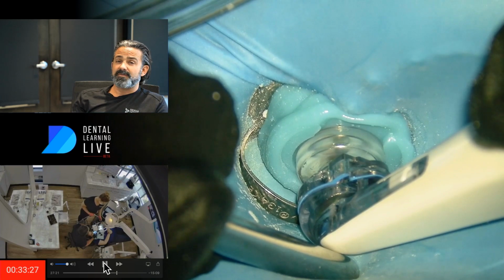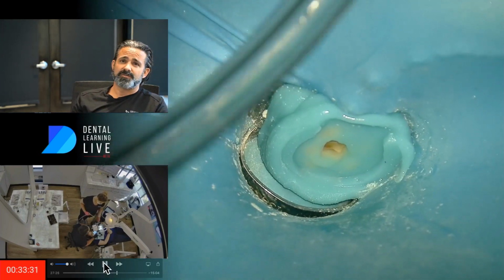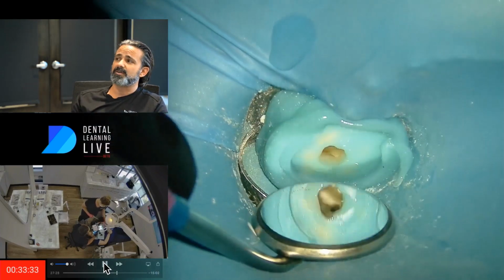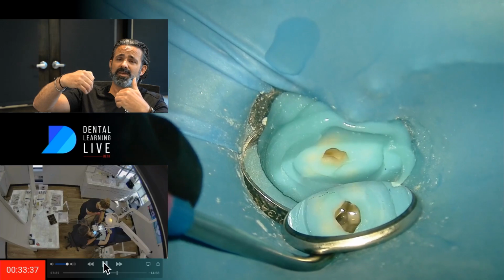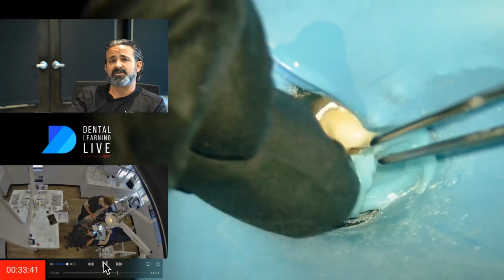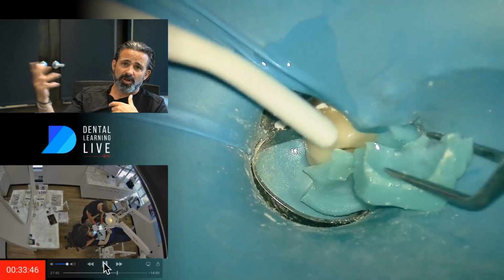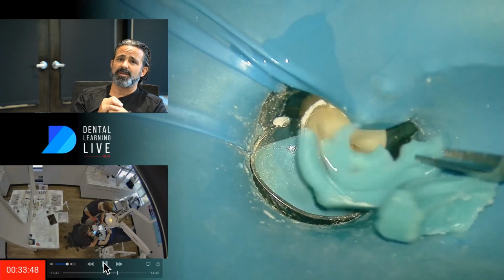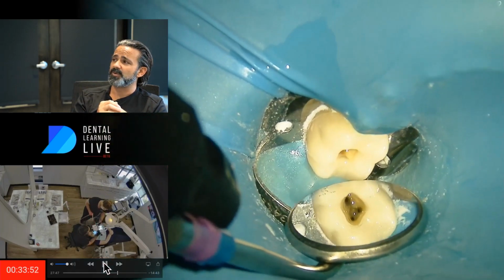And one of the things I found, if it is that the crown's washing out, is you'll find that it is towards the end of the cycle, but when you look in, you'll see heme, because sometimes that can get down and around the crown margins and get down into the gingiva. If that's the case, you'll notice it when you pull it off and inspect. So it's always appropriate to stop and look if you have to, and determine what's going on.